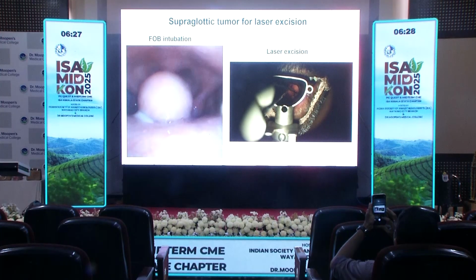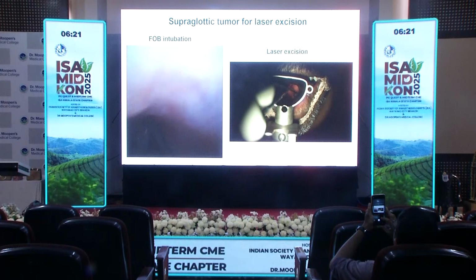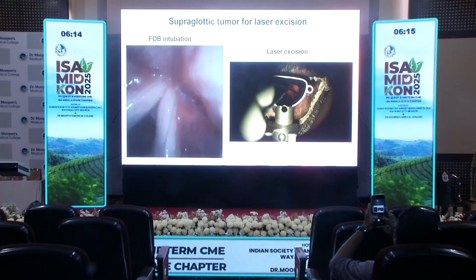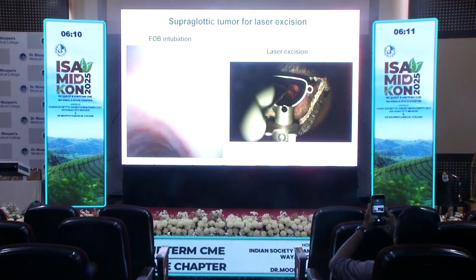You can see the glottic mass, this supraglottic actually. We used a fiber optic and went by the side of the tumor, and there you can see the vocal cord, and lower down the trachea is visible, and patient was intubated like that. It was an oral intubation.